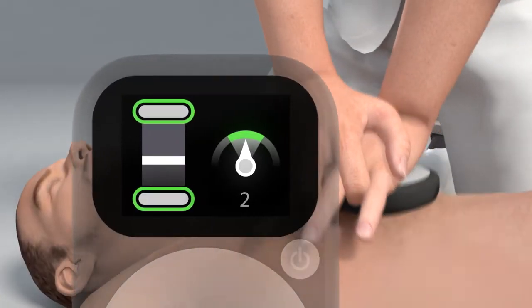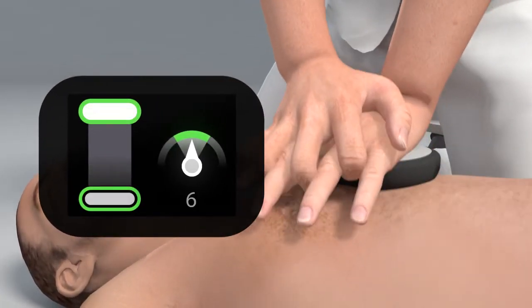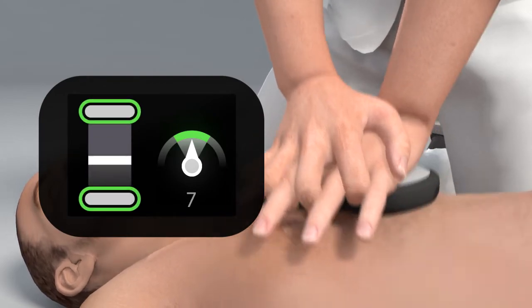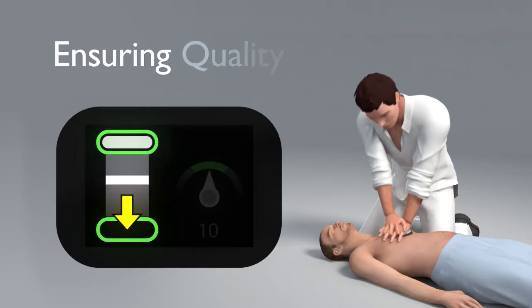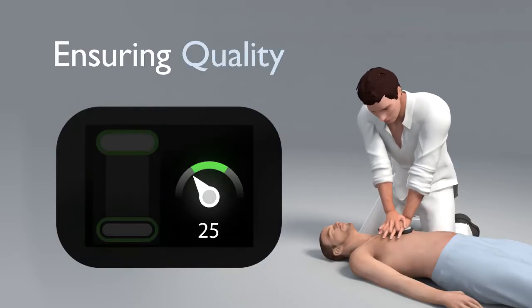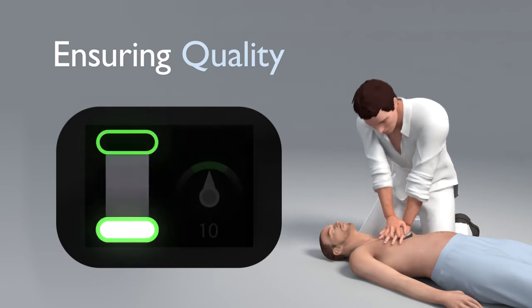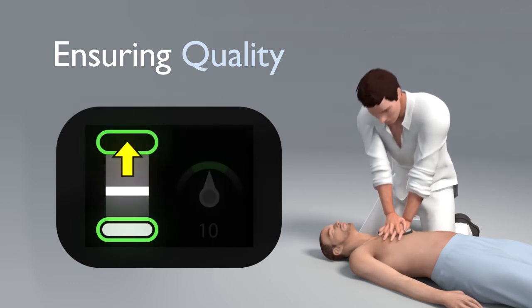Because the device provides you with real-time feedback, you will immediately know whether you should compress deeper, compress faster, or if you're not releasing completely.